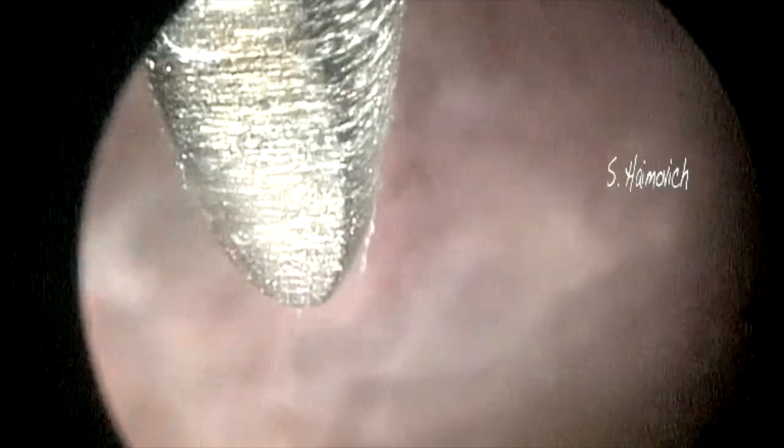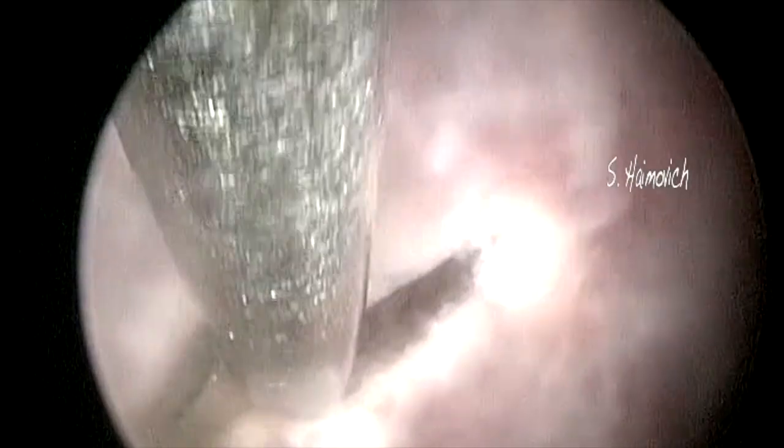We present a case of a hysteroembryoscopy, to a 9 weeks missed abortion. First we see the chorion; with the help of scissors, we cut the chorion and open a way in. Once in the chorion, we are able to see the amnios, with an embryo inside.